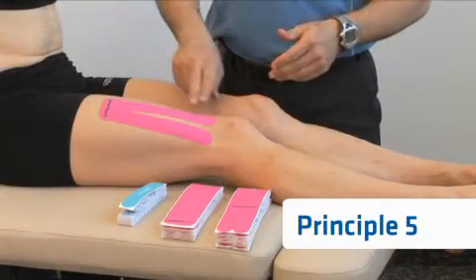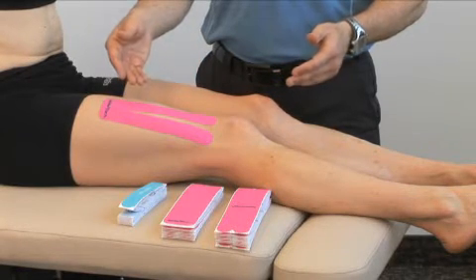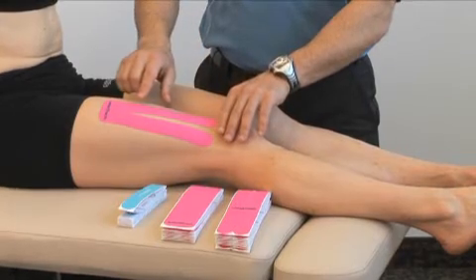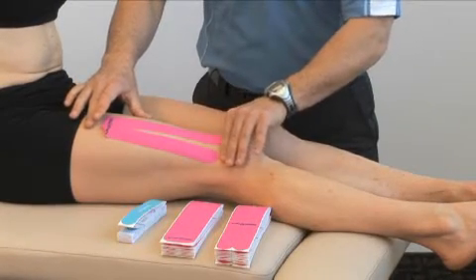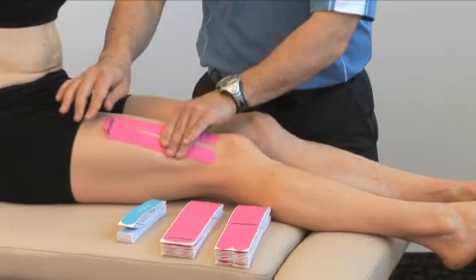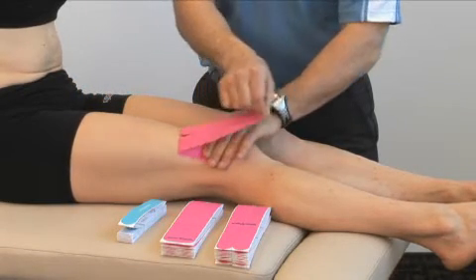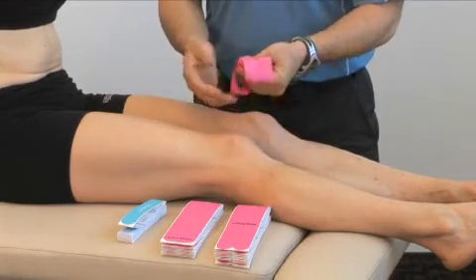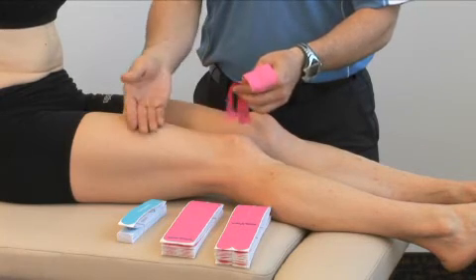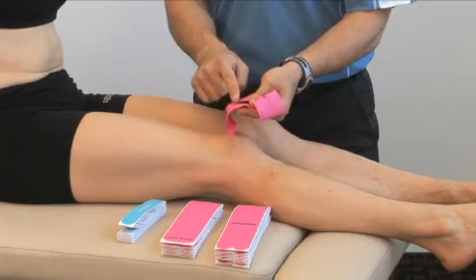Principle number five is how to remove the tape. Once the tape is applied and worn for approximately four to five days, it comes time to removing it. Peel back a little bit of the tape, stretch the skin as much as possible in front of where you're peeling, and then gently pull the tape back. Do not remove the tape when it's wet — always wait for the tape to be dry before removing it from the skin, as removing it when wet creates more suction between the adhesive and the skin.